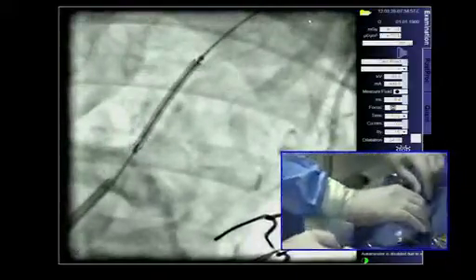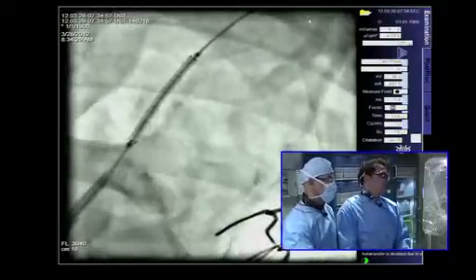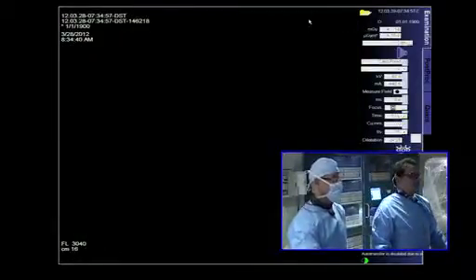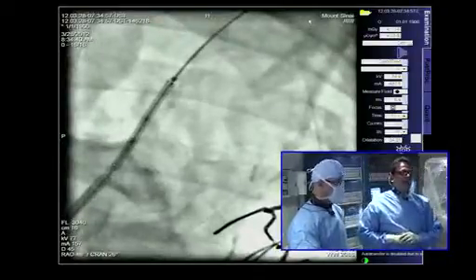Let's go now to the placement of the stent. You saw that this stent navigated extremely well over a wire through the lesion. And PK, what type of stent is this again? Is it a Protege? This is a 7.0 VisiPro. It's a self-expanding stent. Now, excuse me, it's a balloon expandable stent.